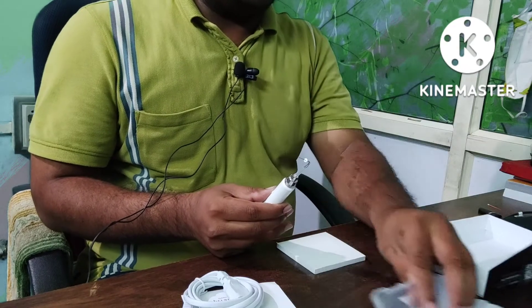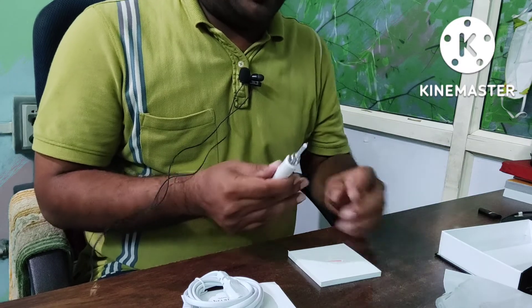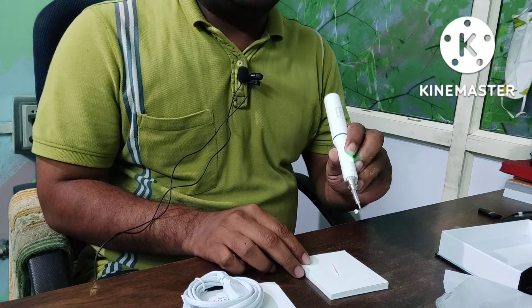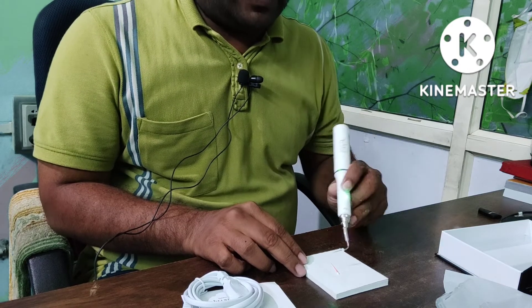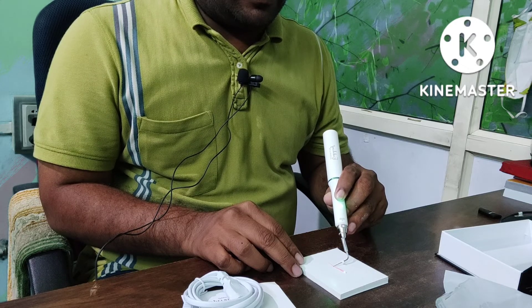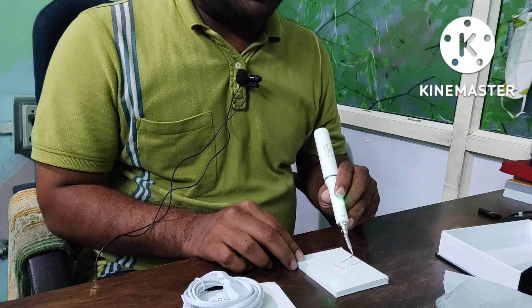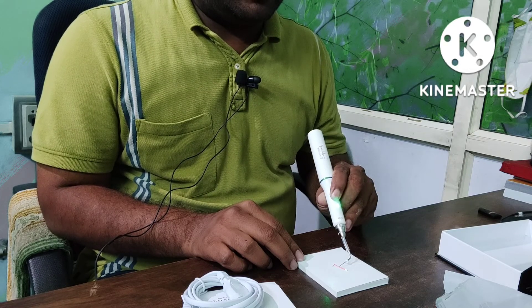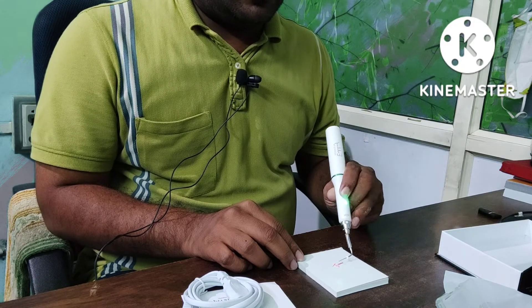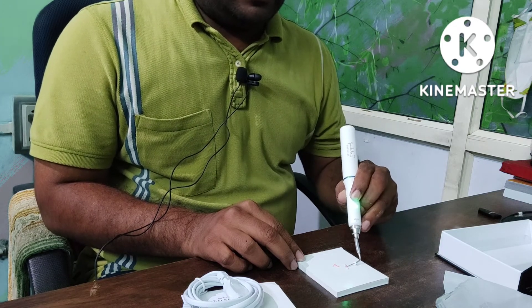I am cutting the gutta-percha. This is gutta-percha — we will cut this gutta-percha. The button is on, so it is getting heated. How perfectly it gets cut — it is getting cut like butter.